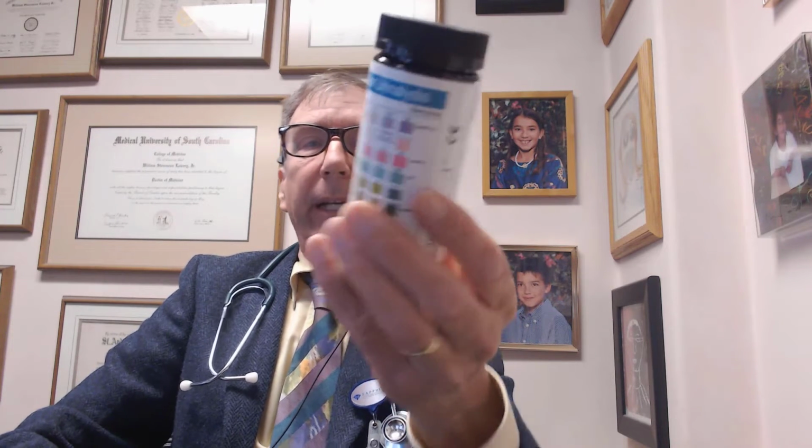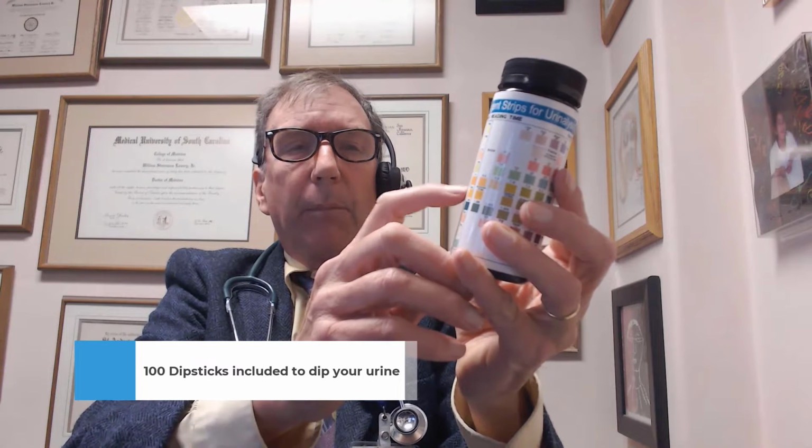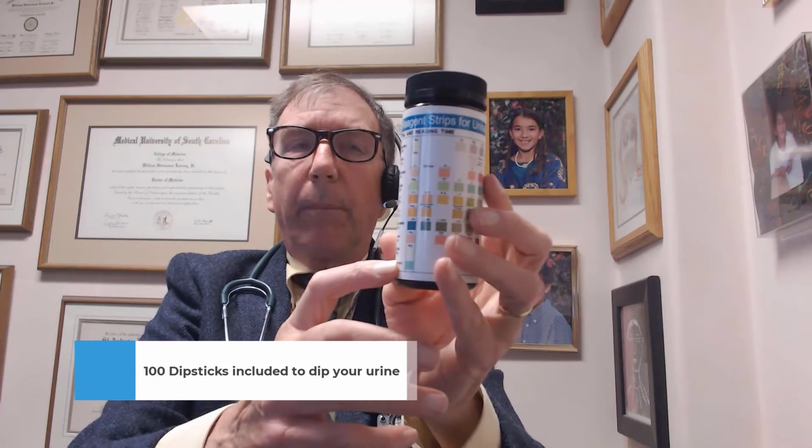And you'll see the panel here that includes leukocytes, nitrite, urobilinogen, protein, pH, blood, ketone, bilirubin, and glucose is usually at the bottom.